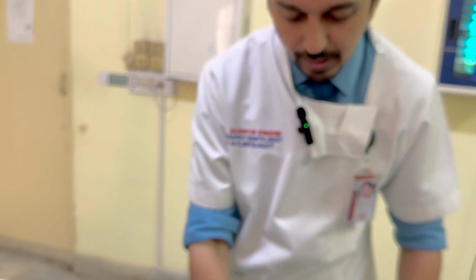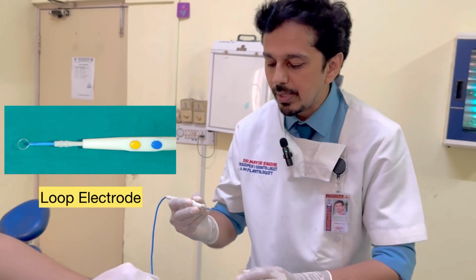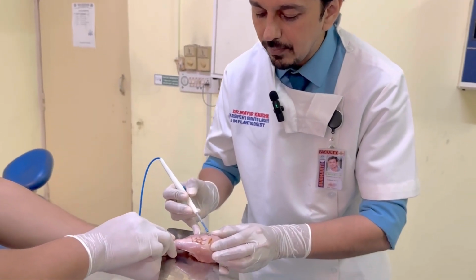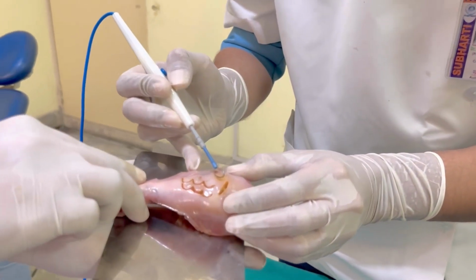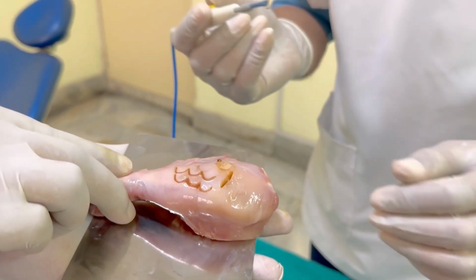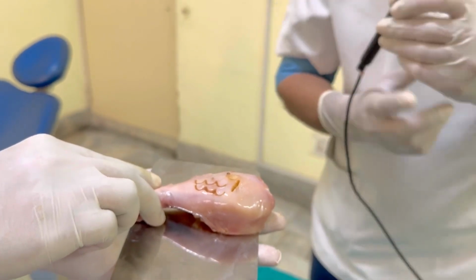At the same time, for excision also, we have a loop electrode. So excision, or rather deepithelization, is comparatively a more superficial process. So can you see? I am using this basically for removing of the epithelium. So where exactly would I be using these modalities?